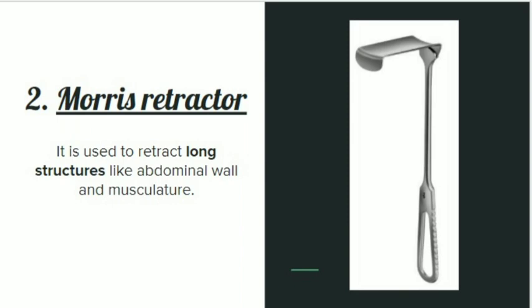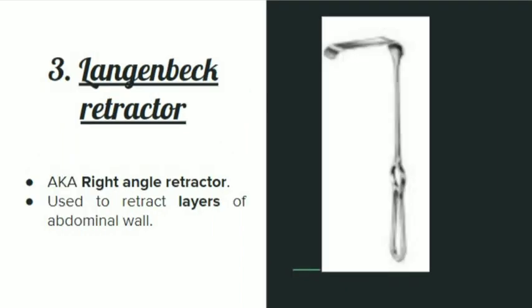The second retractor is the Morris retractor. It is used to retract long structures like the abdominal wall and musculature. It is smaller than the Deaver retractor but bigger than the next retractor. A hook is formed at its distal end, which helps in retracting and holding those structures.